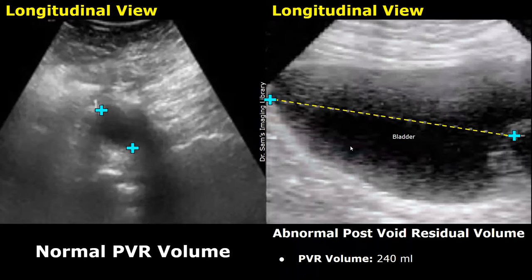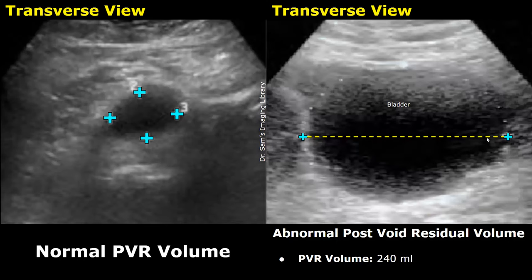This is another example showing an abnormal post-void residual volume. The bladder still appears filled with urine after urination, and the PVR volume was 240 milliliters. This image is in the transverse plane. We can still see a distended bladder despite urination. Comparing this with a normal bladder after urination, you can see a significant difference in size.